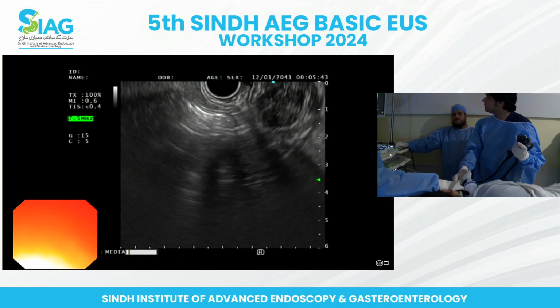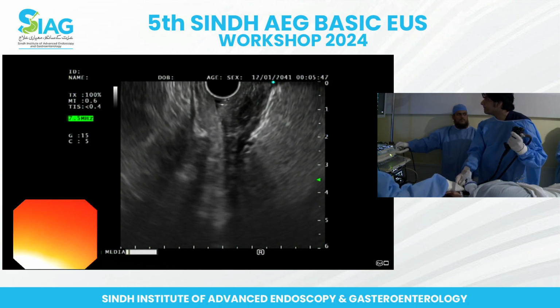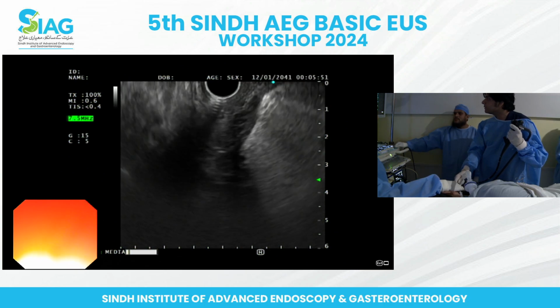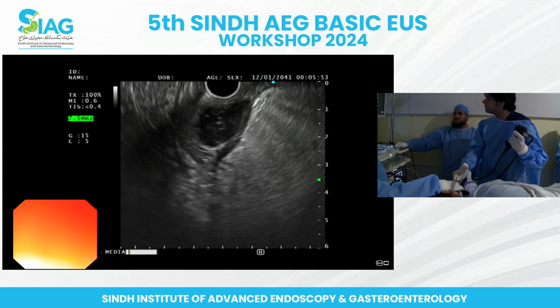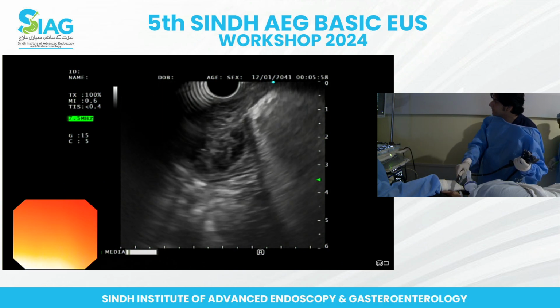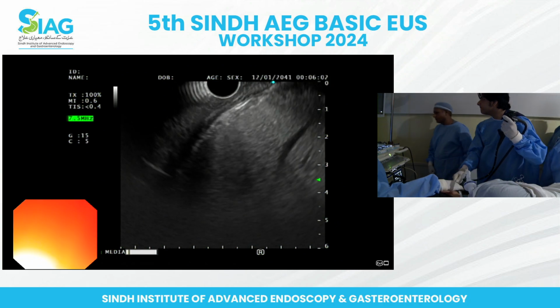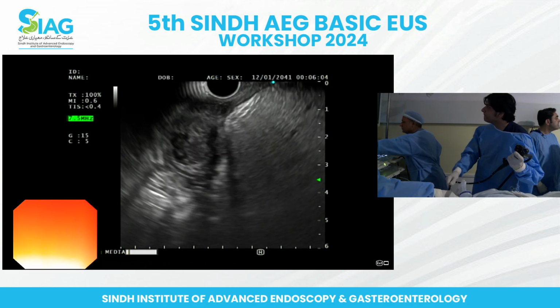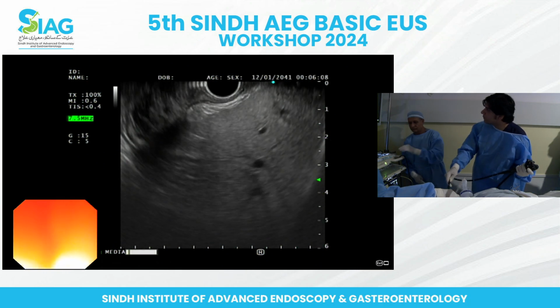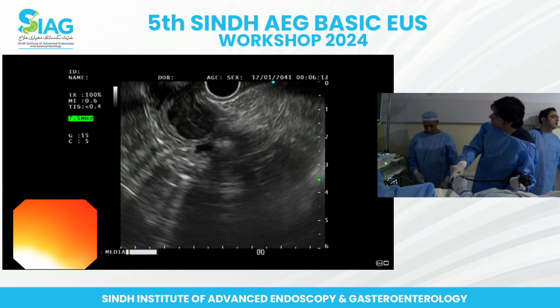Afan, pull your scope back a bit so we can see the proximal side of the lesion. Now spin around. Spin. Other way. Keep spinning. Yeah. जहाँ नीचे में. और खींचें थोड़ा इसको. Scope को और खींचें. और spin करें. Okay, go the other way now. Just slowly go the other way. On the FNA? Okay. Right there. You're looking at that's right. Push forward a tiny bit. साइटोलॉजी.